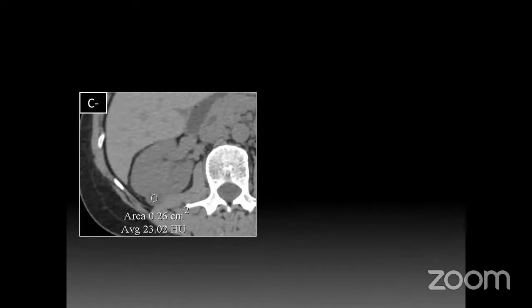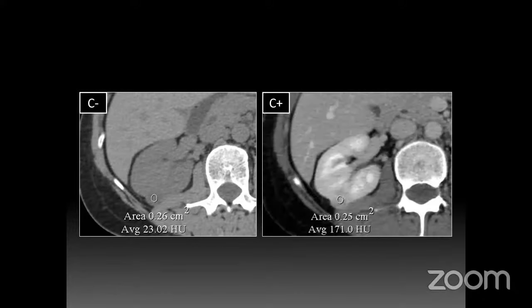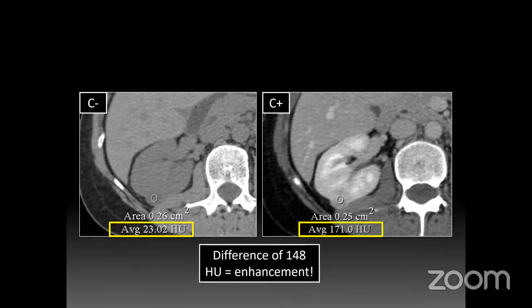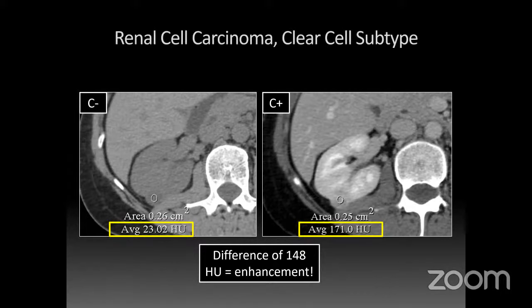In another case, the right kidney lesion measures 23 on non-contrast and 171 after contrast — a difference of 148 HU. That's way above 20, so it's definitely enhancing. When you see a renal mass with this level of robust enhancement, think renal cell carcinoma, particularly the clear cell subtype.